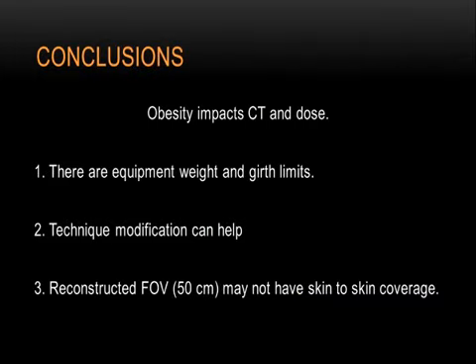So in summary, basically we have to check our weight and girth limits, we have to modify the techniques, and we have to appropriately adjust the reconstructed field of view.